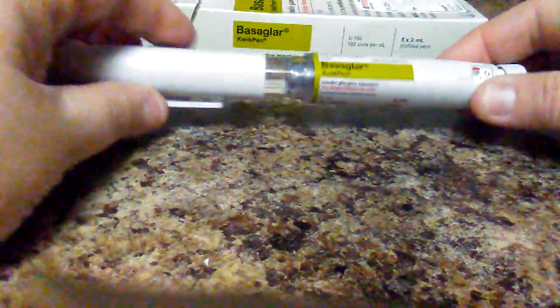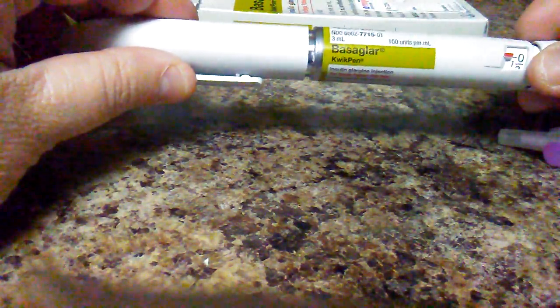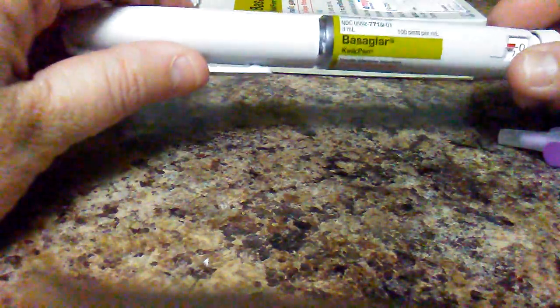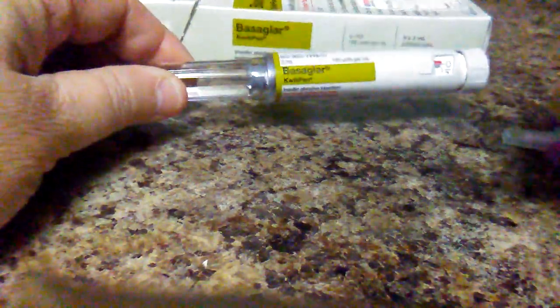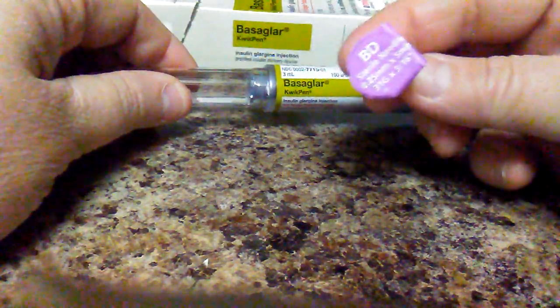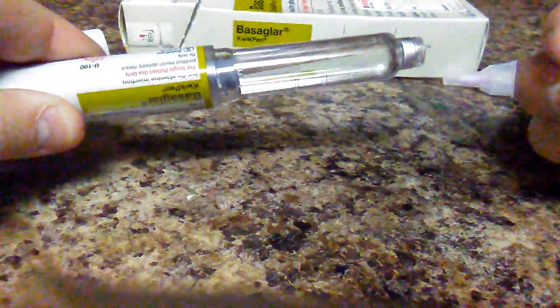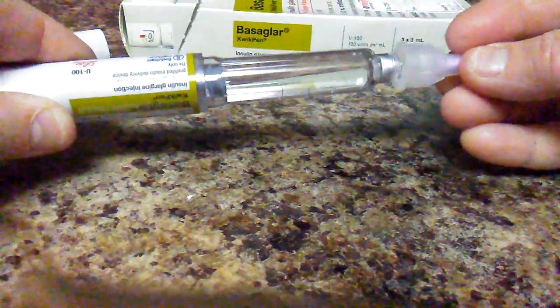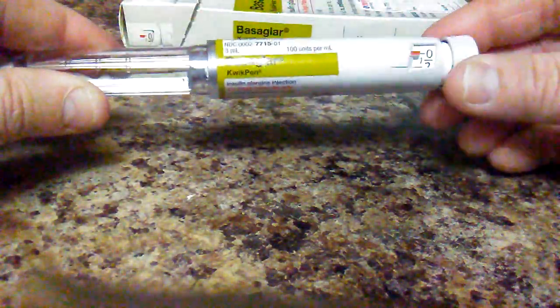Hey guys, I just want to do a quick video on the site — I think it's called Basaglar — and it's for diabetes. It's real easy to use. You just take the lid off, take one of these little BD Ultra-Fine sterile needles, take this off, and you just put this on here like this and twist it like that.